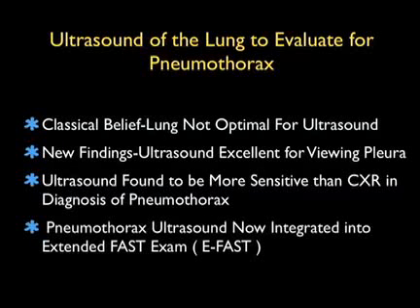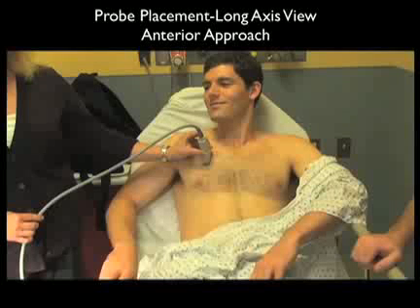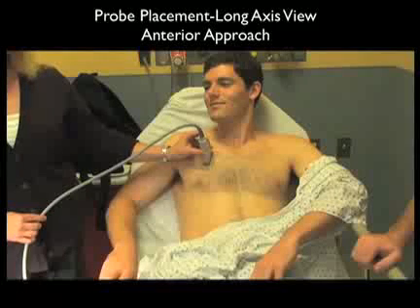And now we're going to add on views of the lungs looking for pneumothorax as part of our extended FAST exam, or the eFAST exam that we'll be performing in trauma patients. We can also detect pneumothoraces in our medical patients. Now let's learn how to perform the ultrasound examination for pneumothorax detection.